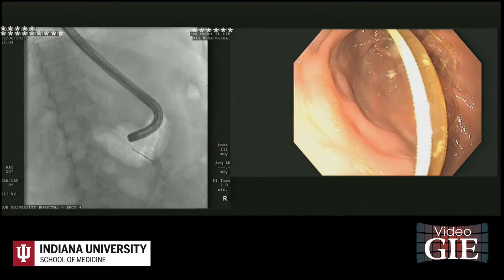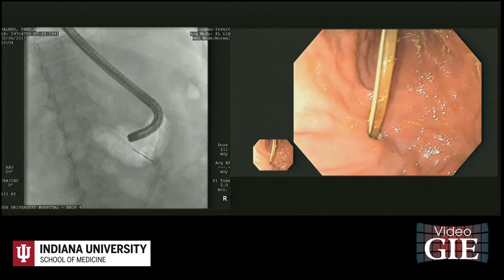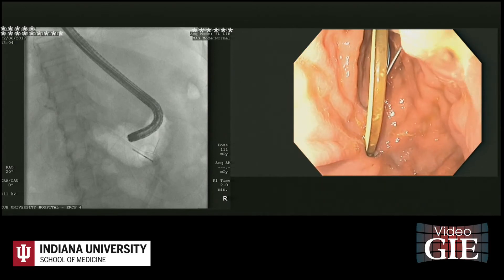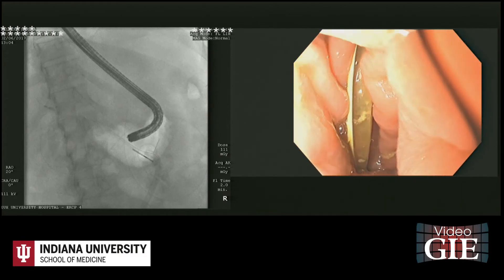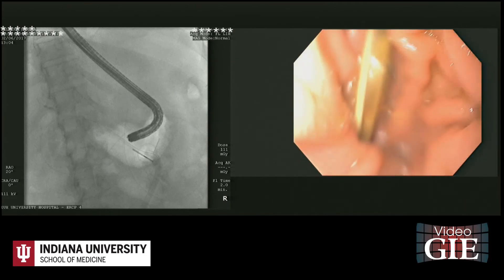Two T-fasteners, one on each side of the existing gastrostomy tube site, were placed within the gastric lumen and pulled back to the level of the gastric wall, then sutured to the skin. The T-fasteners were placed within the gastric lumen.